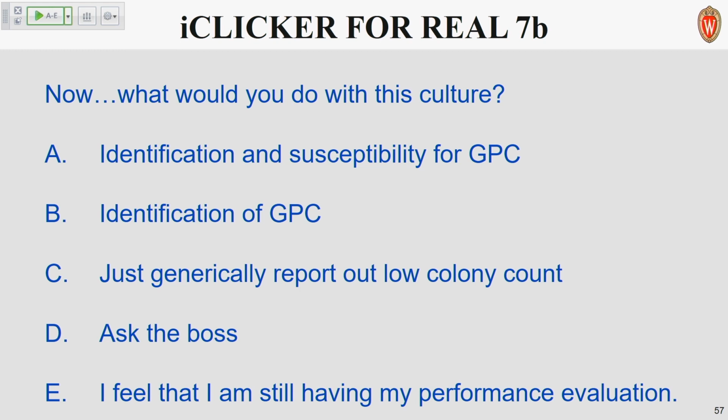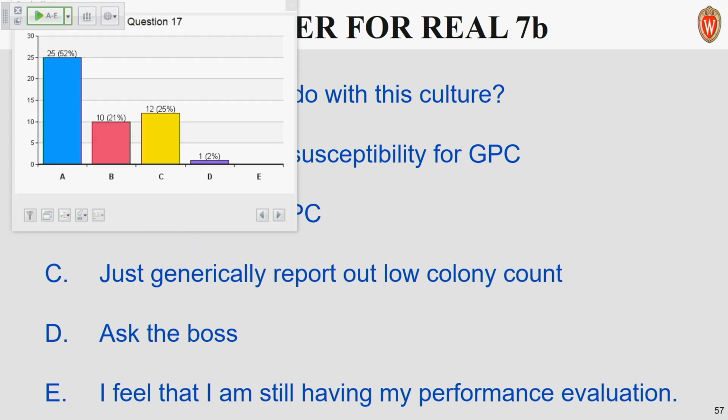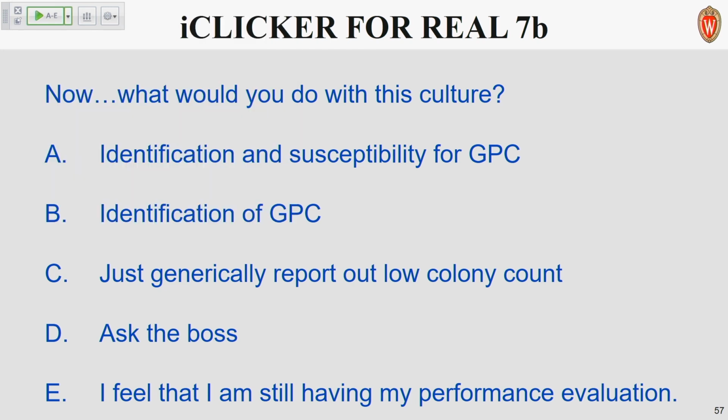Same culture findings, ton of leukocytes on the UA. Microscopic, I'm sorry. But only like 21 on microscopic. Well, that's true. That's more than 3 to 5, yeah. That would qualify under the new reflex criteria. Still working these up. So we have some more people dipping their feet in the pond. Yep. Brooke.